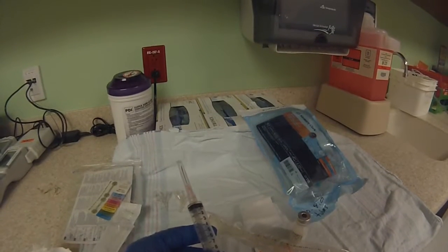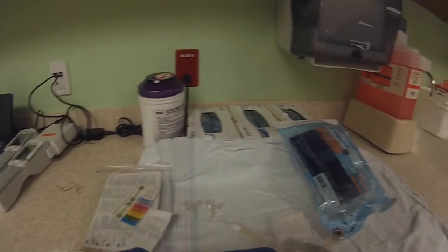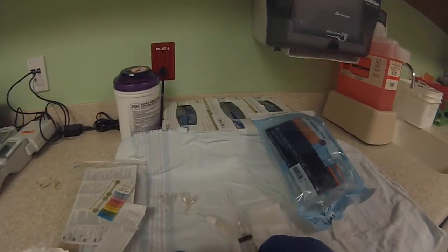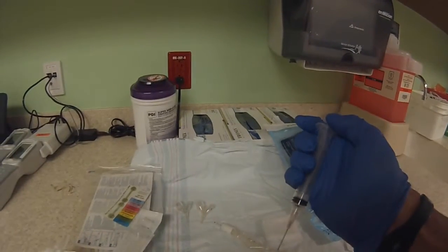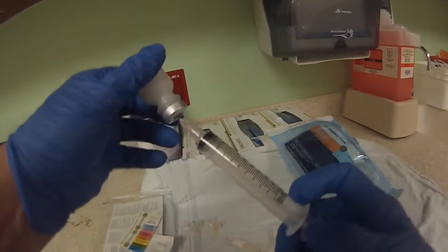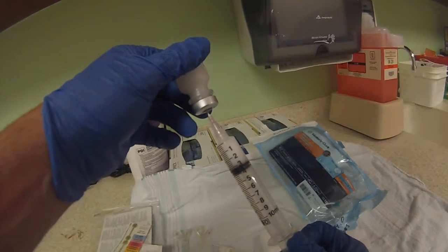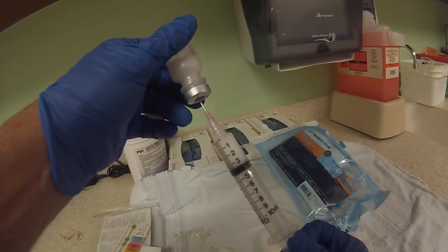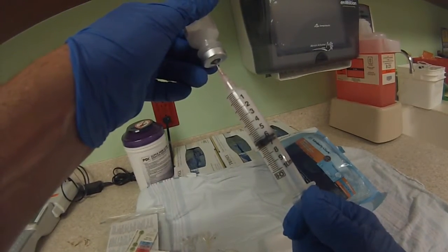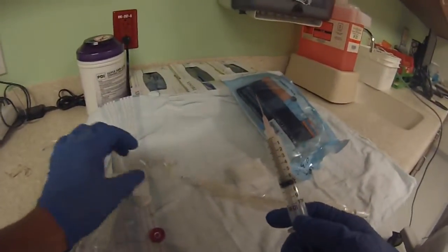The doctor is going to order 6 mL's. First thing you want to do is you want to wipe off the top of the InfoSurf canister. Pull back a little air, push the needle in, and you want to withdraw 6 mL's. But since you want 6, you need to pull back a little more to make sure you have enough to prime your catheter.